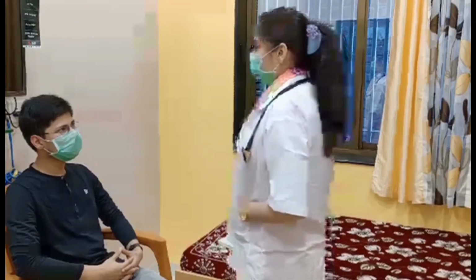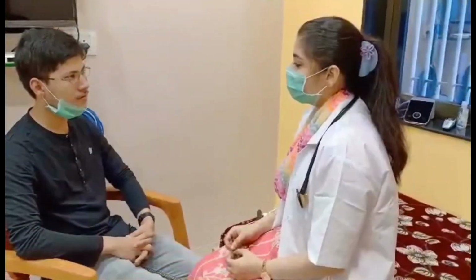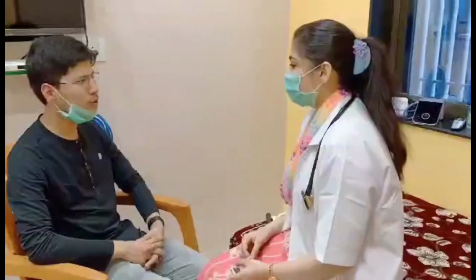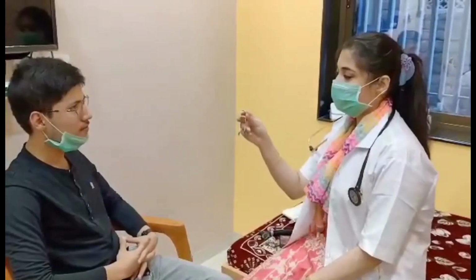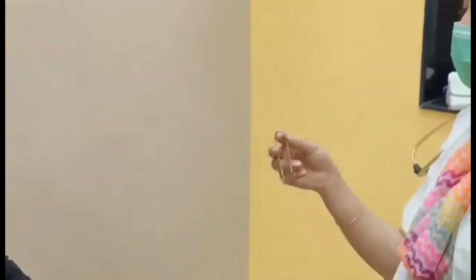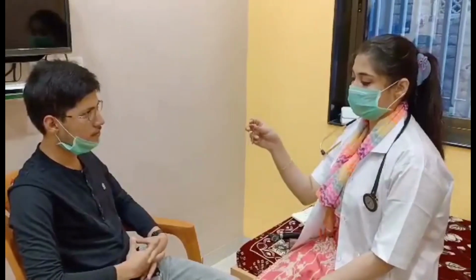I'm Ansari Faiza. I'm going to perform anterior rhinoscopy. I'll inspect your nose. Have you got any pain or tenderness around your nose? This is a nasal speculum. I'm going to use the nasal speculum to examine your nasal cavity. We hold it like this with the help of the index finger.